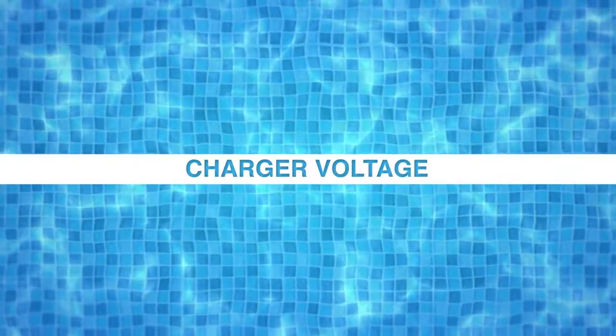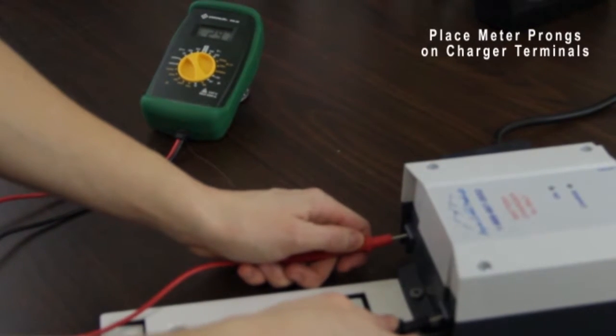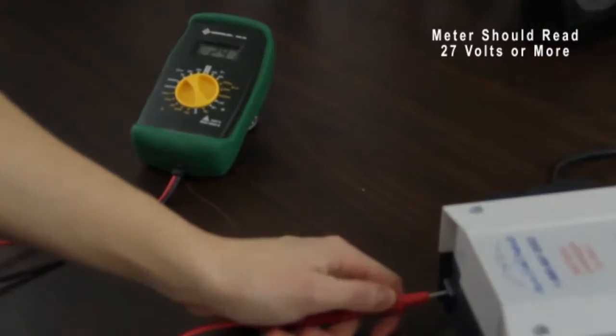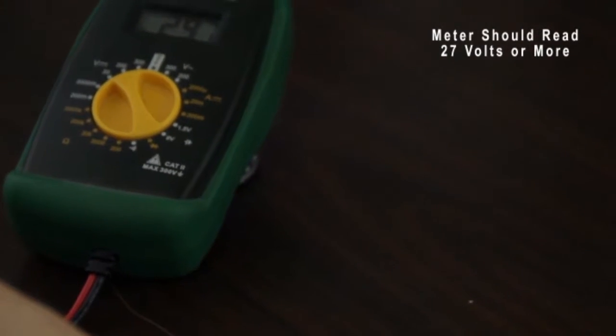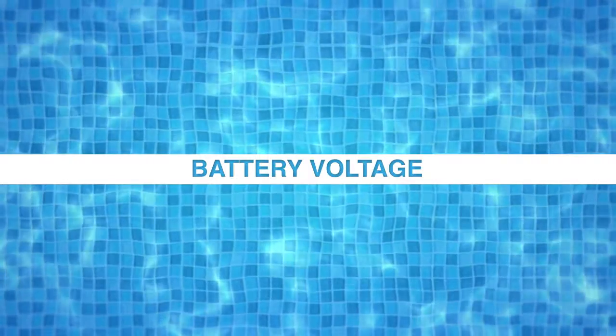To check the charger, make sure the charger is plugged in. Using your voltmeter, place the prongs on the charger terminals. A good charger will read around 27 volts or more. If your charger reads below 27 volts, it needs to be replaced. If your charger has proper voltage and your lift still doesn't work, you will need to check the battery voltage.